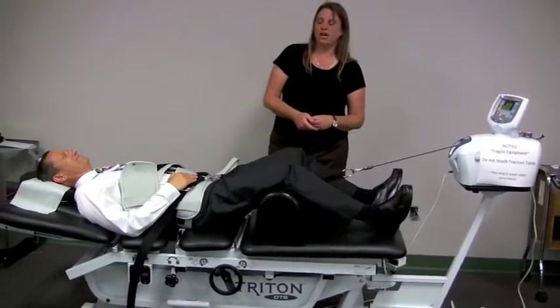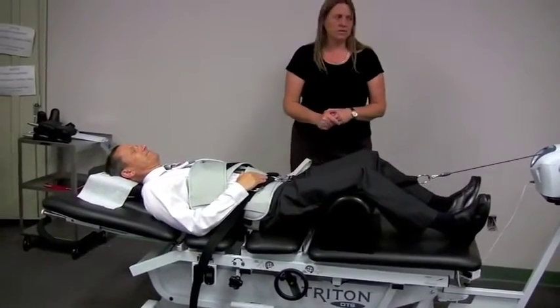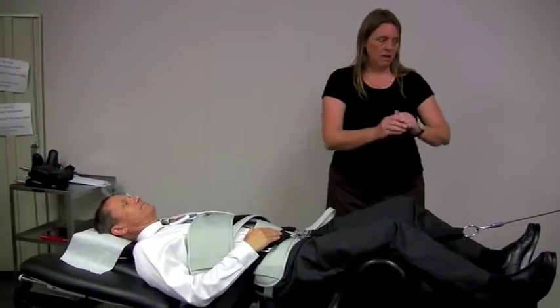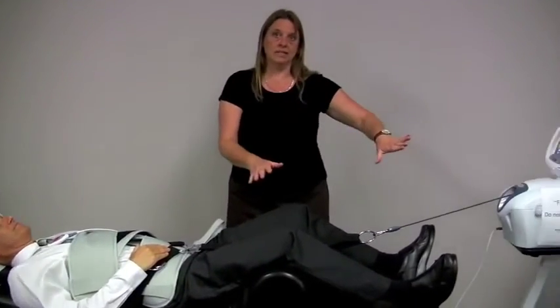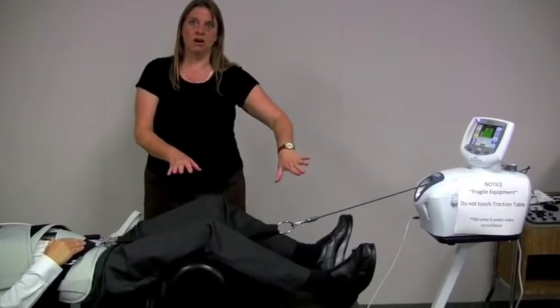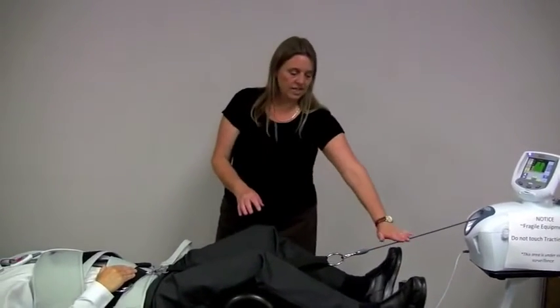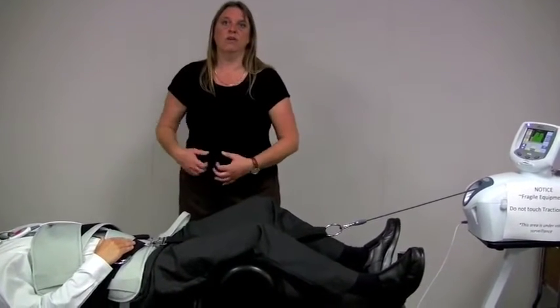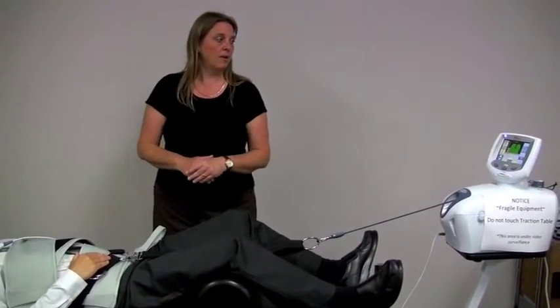The most important thing also, what will happen if there is a power outage? It is stated in the manual. If there's a power outage, everything will slowly, it'll just release. It'll allow anything to be taken off. So this will release its tension, and of course nothing else is electronic on him, so he would be able to get out of the apparatus.